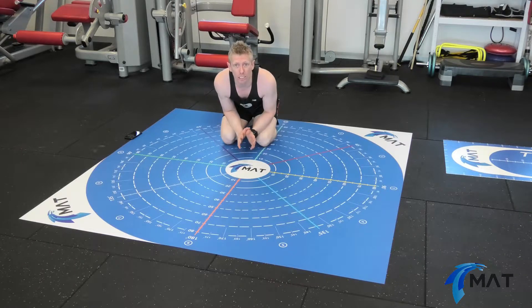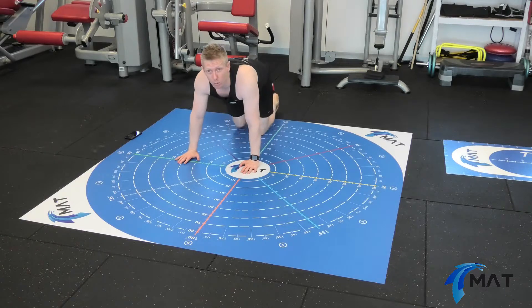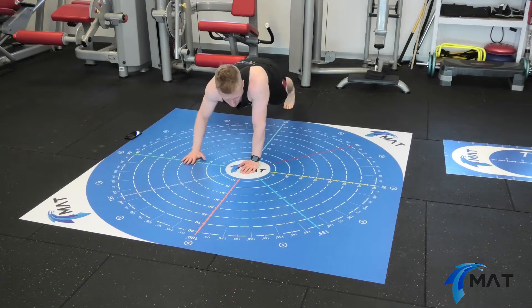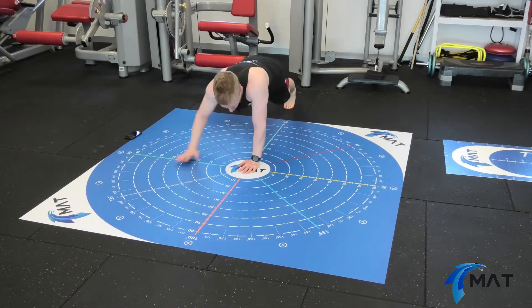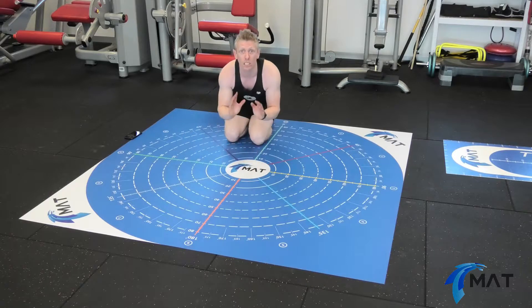We're going to have a look at the closed kinetic chain upper extremity test to set some baseline data that we're going to track over time utilising the mat. Using the MegaMat, I'm going to adopt a push-up position, feet hip-width apart, and I'm going to perform the upper quarter Y balance test. I'm going to reach in all three directions and take an average of three reaches in those directions.